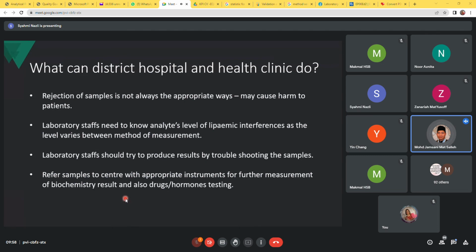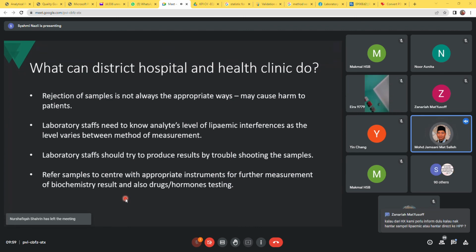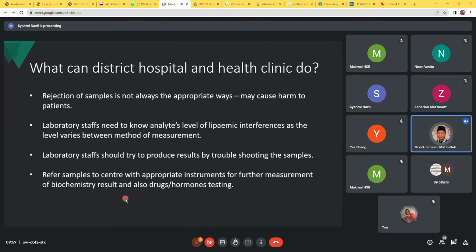warrant for further investigation. Kalau katakan bila buat analisa, biasanya untuk keputusan lain dia tak akan dapat bagi keputusan. Tapi kalau untuk lipid profile, TG ataupun kolesterol, kemungkinan analisa itu boleh dibuat tapi dia akan bagi more than test.